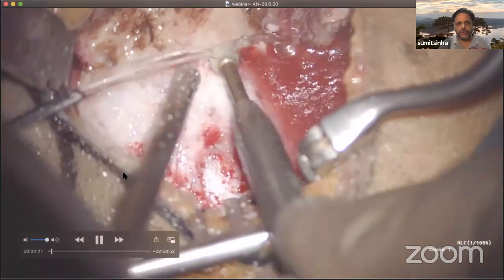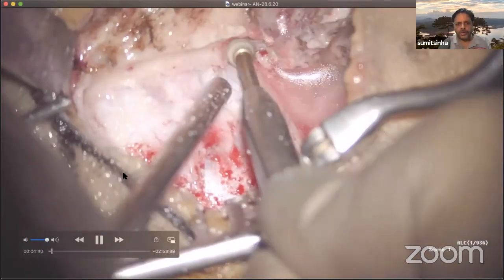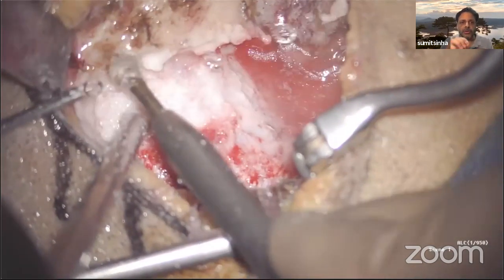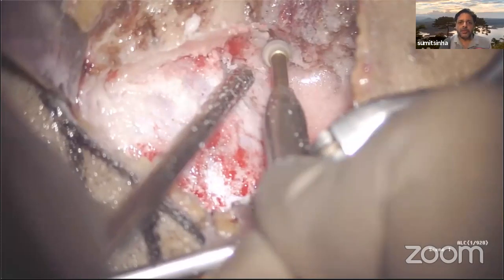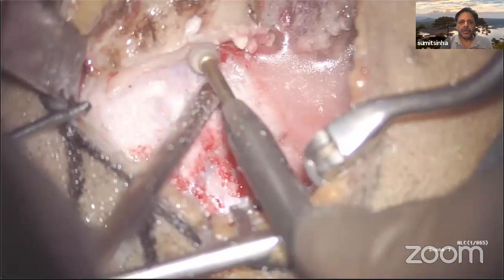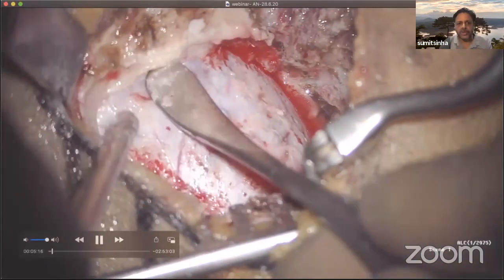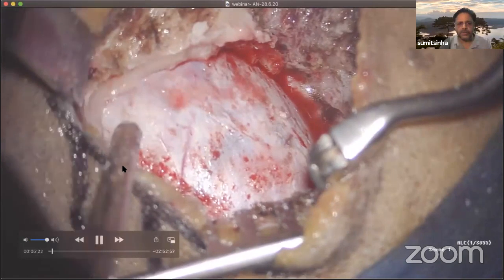So I am fast forwarding a little. And you see that every effort should be made not to let the air sinuses open, because once they get open, the patient runs the risk of morbidity of CSF otorrhea or CSF rhinorrhea. So all the efforts should be directed towards not opening them. And you have to study the preoperative MRI and preoperative CT scans of the patient in order to know the extent of the mastoid air cells. Now you have to assess where the sigmoid sinus is. Yes, it is very nearby, and some more drilling may be required.